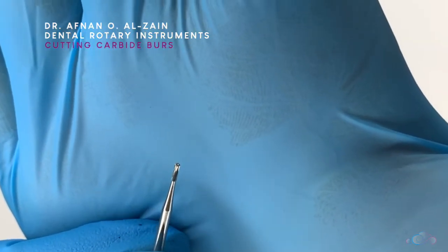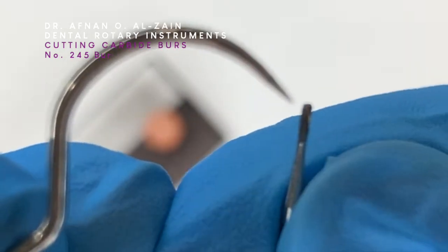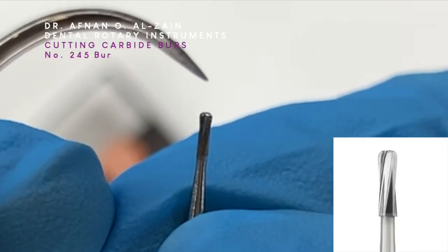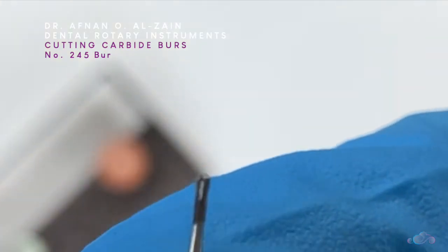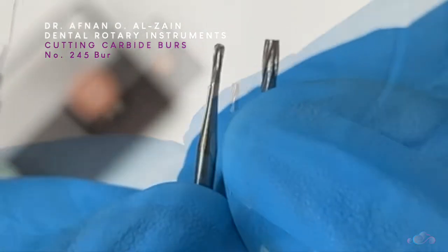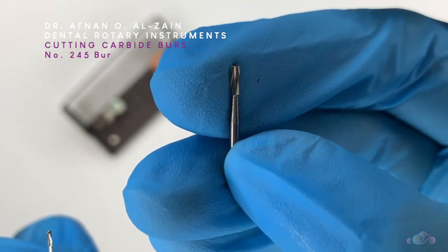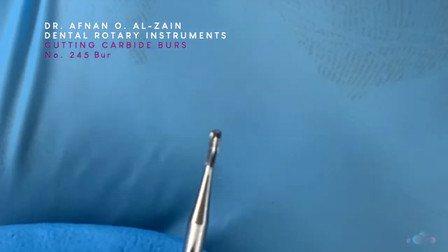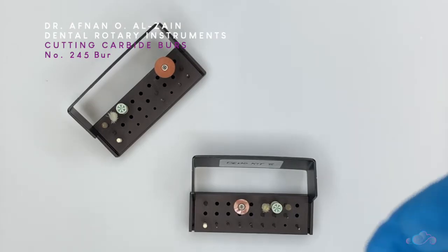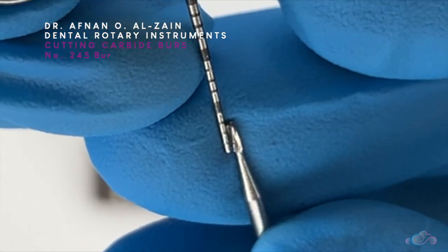We will discuss the differences between the high and low speed burrs later in the video. Moving on to the second burr — this is the number 245 burr. We can see that it is not completely cylindrical, but it has a rounded edge. The head is rounded, it is not flat such as the carbide straight fissure burr. The straight fissure burr is cylindrical with a flat top and is side cutting, but the number 245 burr is side and end cutting. When we measure the length of the head with the perioprobe, you can see it is 3 millimeters in length.